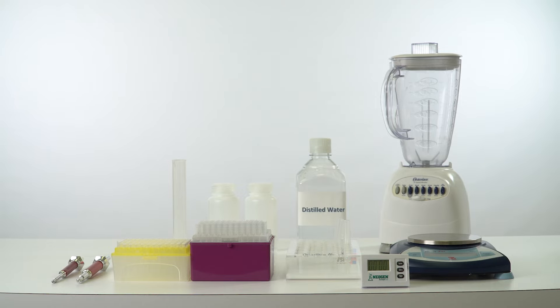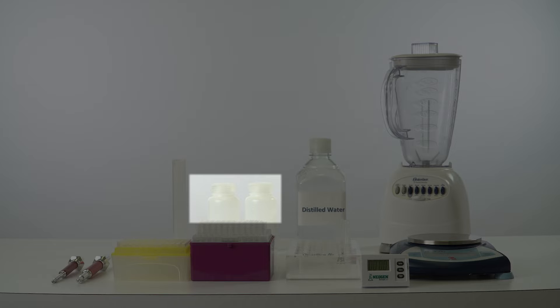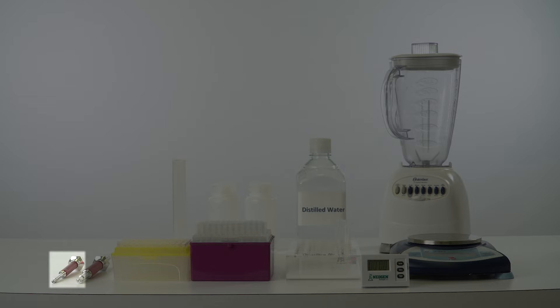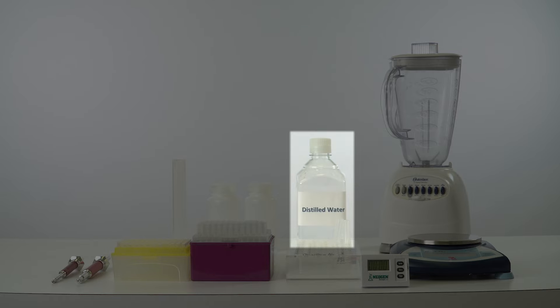To conduct the test, you will also need a graduated cylinder, sample extraction bottles, sample collection tubes, a blender, a scale capable of weighing 10 to 50 grams, a 100 microliter pipetter, 1 to 200 microliter pipette tips, a 1000 microliter pipetter, 100 to 1000 microliter pipette tips, a rack for Reveal sample cups, a timer, waterproof marker, paper towels or equivalent absorbent material, and distilled or deionized water.